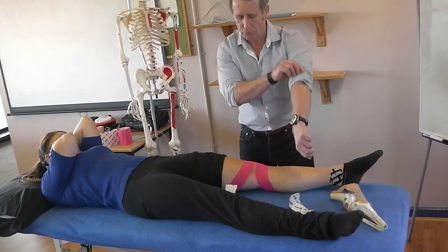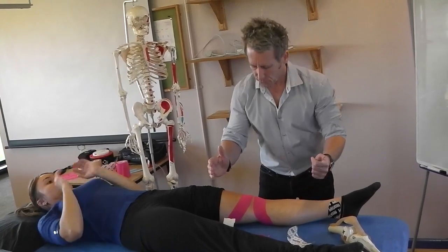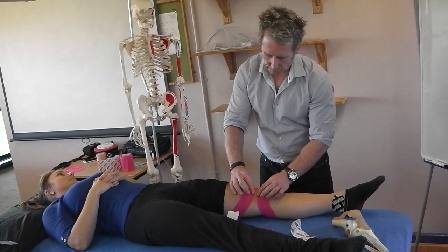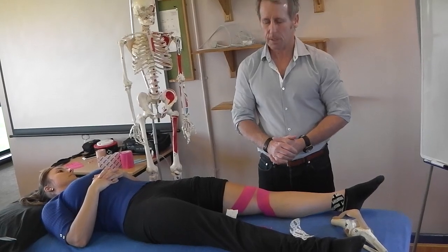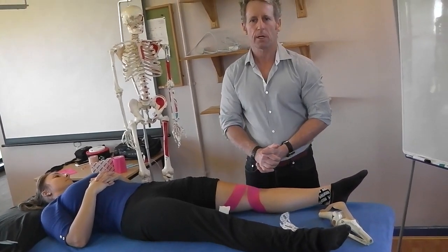Then we would retest the patient. Get the patient to stand and do a bending test, some sort of squatting, or walking downstairs to see if that would reduce the knee pain. And that would be patella femoral pain syndrome taping — a maltracking type of taping for anterior knee pain.